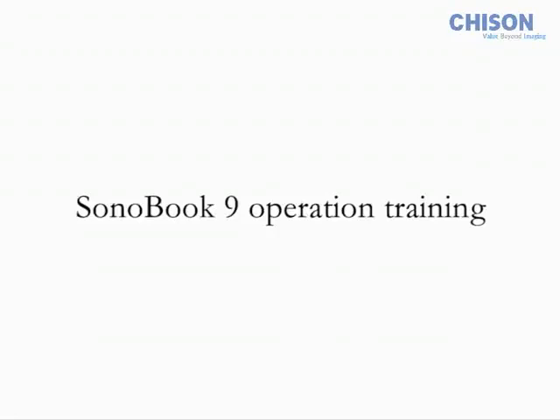Thanks for choosing Chison SonoBook9. Now we are going to give you an operation training.